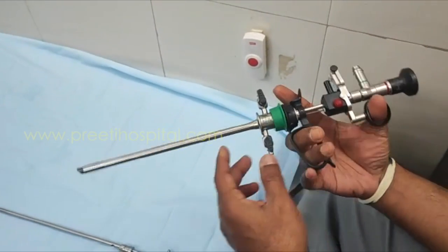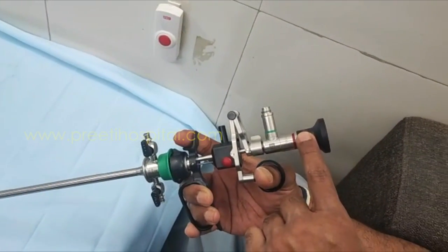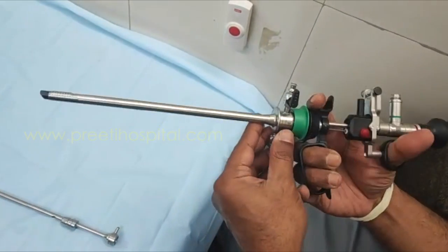So the loop is different but the telescope is the same. This is 22 by 24 Wolf, which is very useful in small urethra for TURP. Thank you.